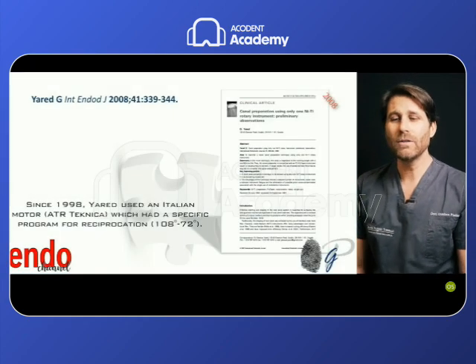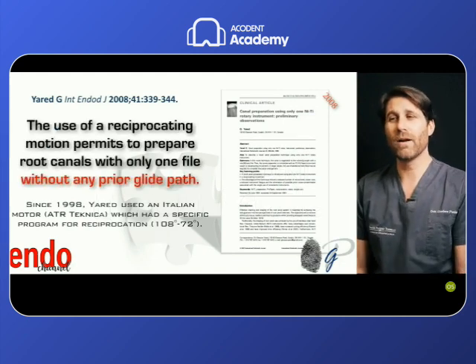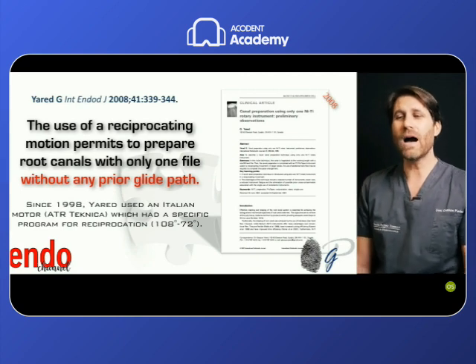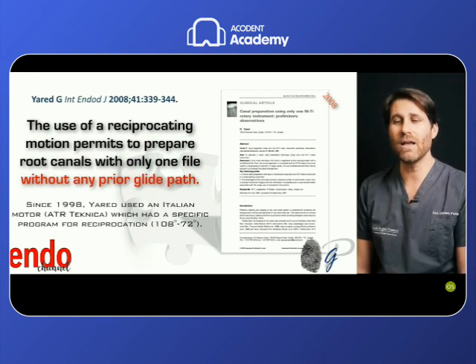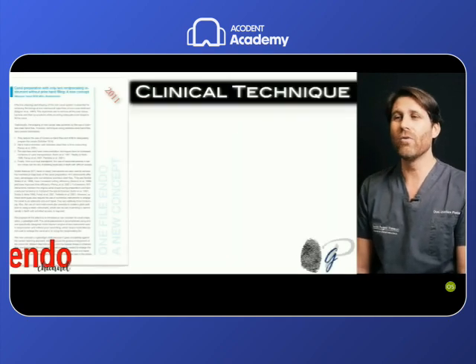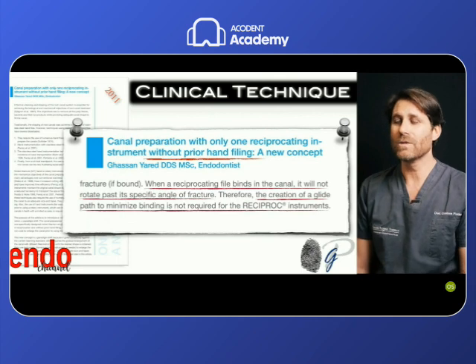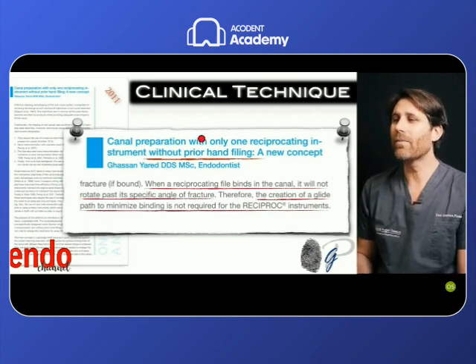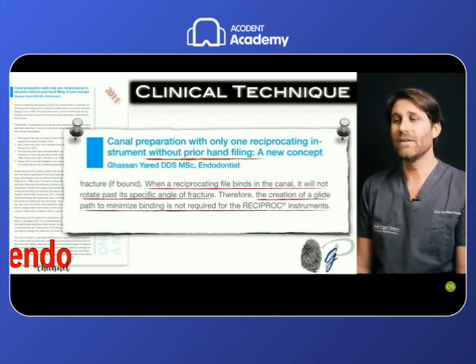We clearly know from the previous lessons that the use of a reciprocating motion permits us to prepare root canals with only one file without any prior glide path. Gassan-Yared introduced this technique in 2008 and has produced his own files on the market since 2011, in which the clinical technique described was without any prior hand filing, because when a reciprocating file binds in the canal, it will never rotate past its specific angle for fracture.